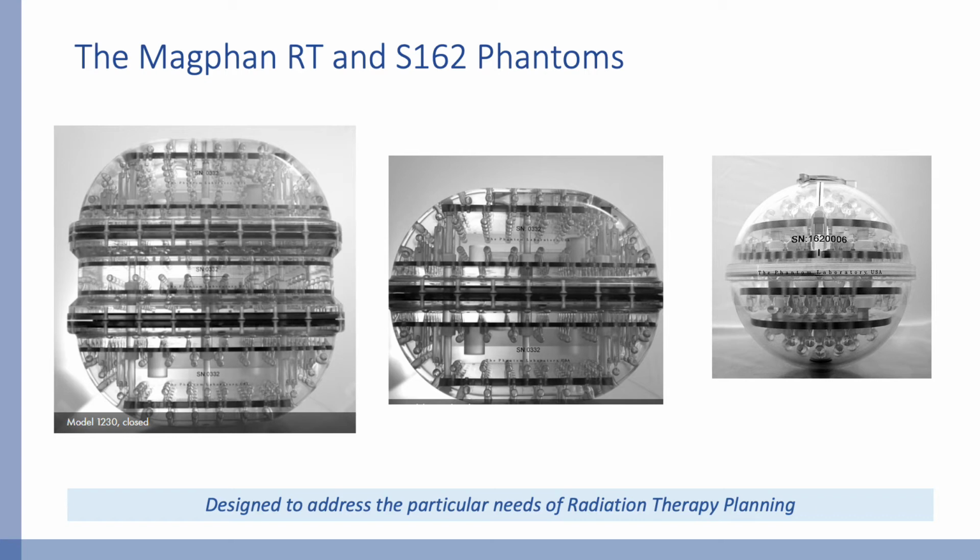The major advantage of these phantoms is that they combine high precision, 3-dimensional nonlinear distortion measurements, while at the same time providing a thorough check on the MR system, all from a single scan. Furthermore, actual clinical sequences can be scanned as the basis for the quality control, rather than a prescribed set of test scans.